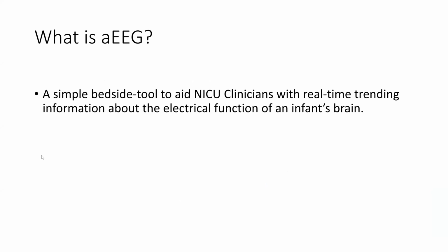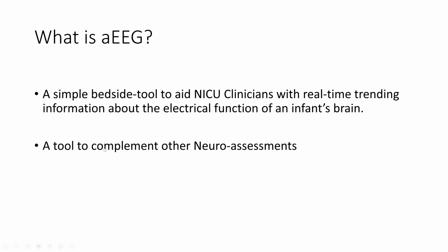So what exactly is aEEG? It's a simplified bedside tool that gives us as NICU clinicians the ability to have real-time trending right at the bedside. And it's all about the electrical function of the baby's brain. We use this to complement our other neuro assessments. It doesn't replace other things. It's a full complement. And I want you to really appreciate that.